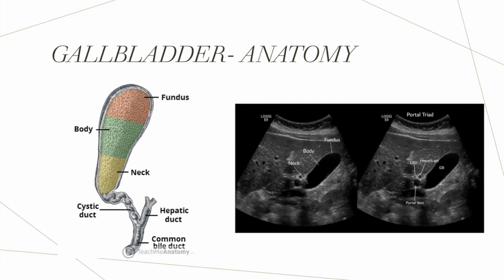It's very important as we go through here to keep the same orientation as well as our systematic review of an ultrasound image. What we want to do is figure out exactly what kind of probe we have first, and then go through what kind of orientation we have, as well as looking at all structures.